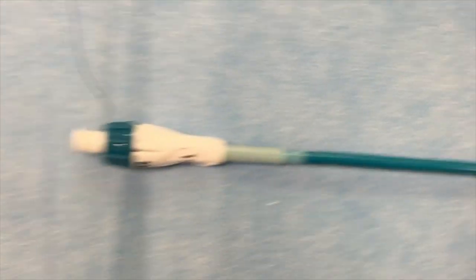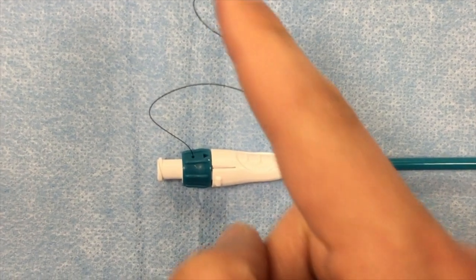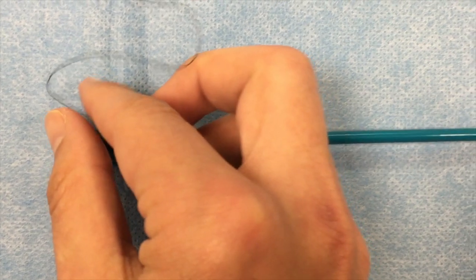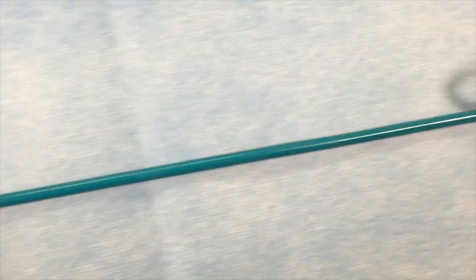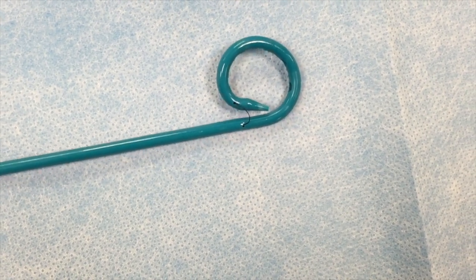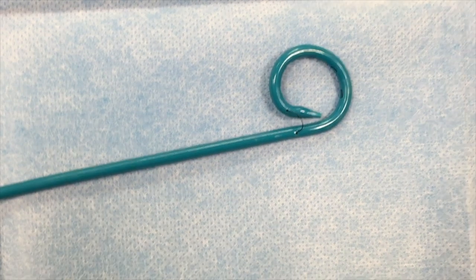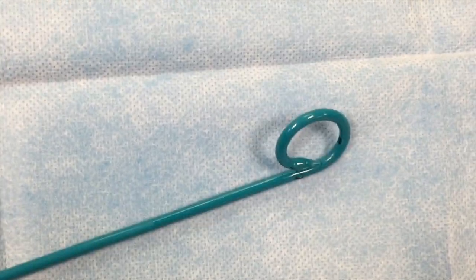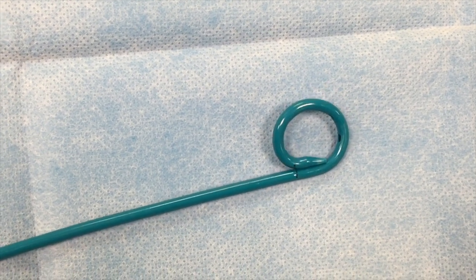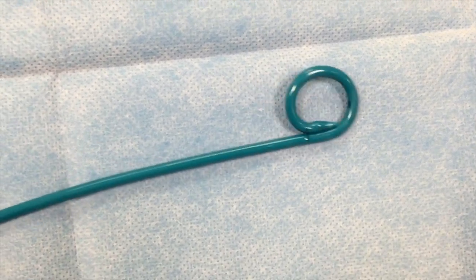This suture here at the end — if you pull this black suture, this will curve the pigtail once it's in the collection. So you'll see if I grab this and look down here, you'll see this little suture on the end. And if I pull this with one hand, you'll see it pulls on it and it'll pigtail the catheter when it's in the collection.